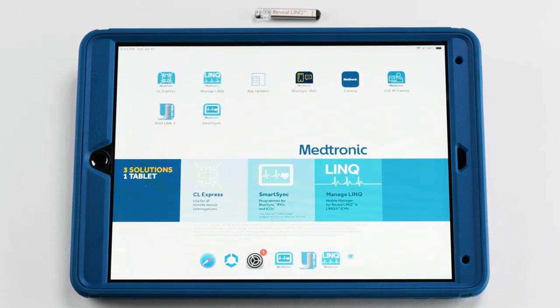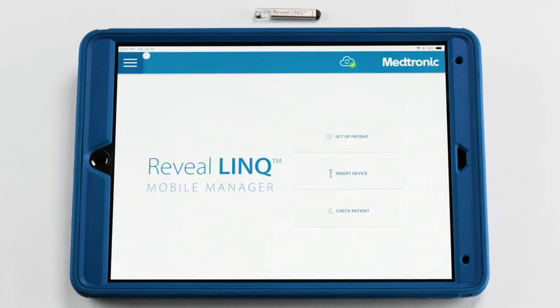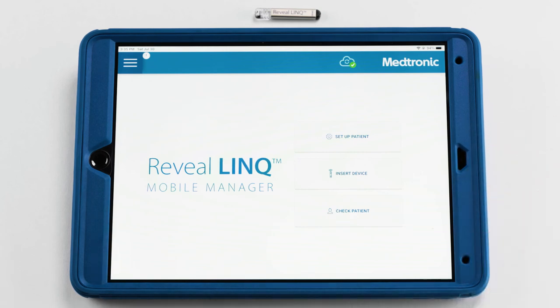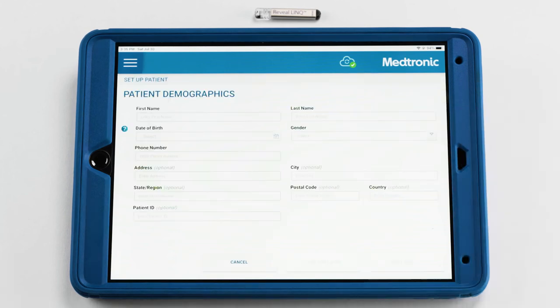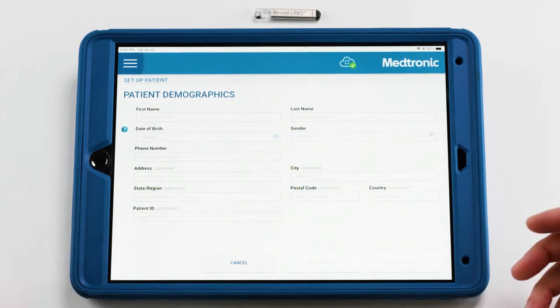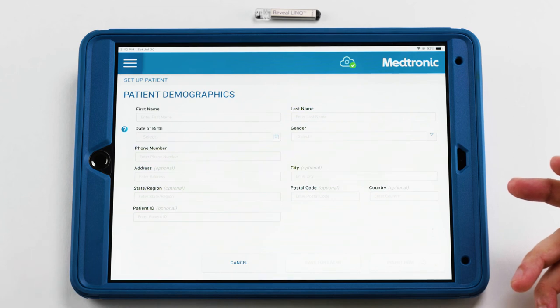When you open the Medtronic Reveal Link Mobile Manager app, there are three main tiles: set up patient, insert device, and check patient. You're able to set up the patient up to seven days prior to the insertion date. Doing this ahead of time optimizes the workflow and prevents intraoperative delays. When filling out the patient demographics, best practice is to complete all of the fields on the screen, including those labeled as optional. This will ensure a smooth registration of the patient into the CareLink network.